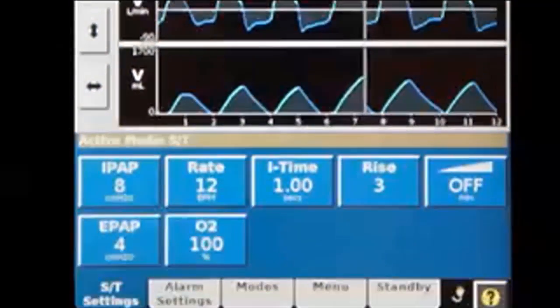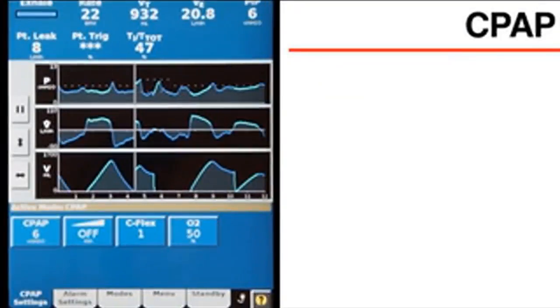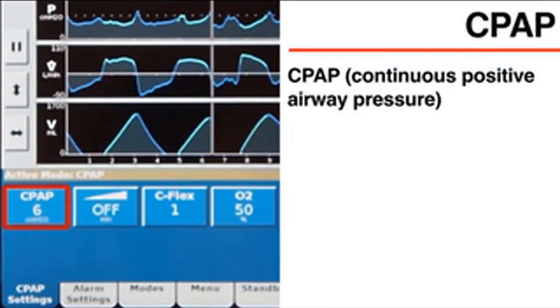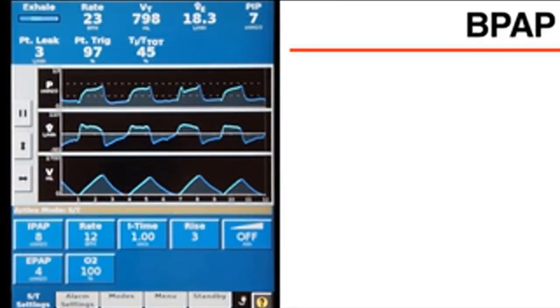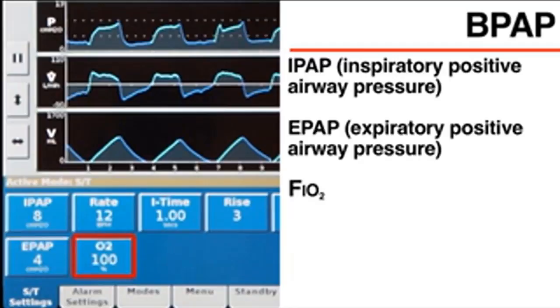The available settings depend on the mode. In CPAP mode, the basic settings include CPAP itself as well as FiO2. In BPAP mode, the basic settings include IPAP, EPAP, and FiO2.